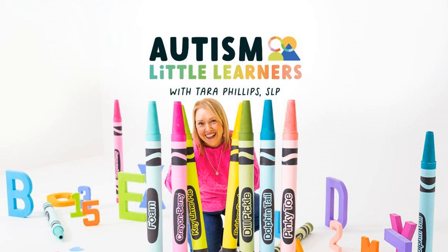The other thing you want to think about is starting small. So embedding AAC doesn't mean modeling every word all day long or full sentences. Start with 1 or 2 routines like snack and circle time and choose a few words to target. This is going to help both the adults and the child learn the vocabulary and where it might be on a core board or a device. As modeling becomes more natural, expand to other parts of the day. Small steps add up, and every model helps a child understand that their AAC voice matters.